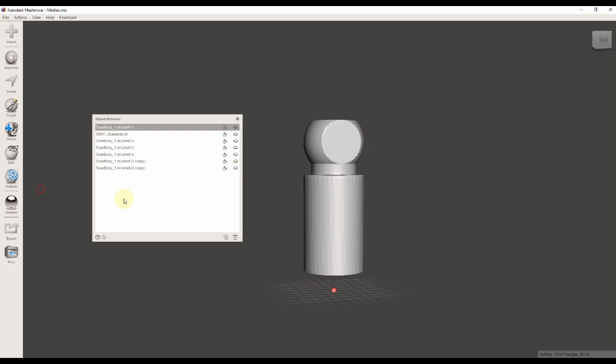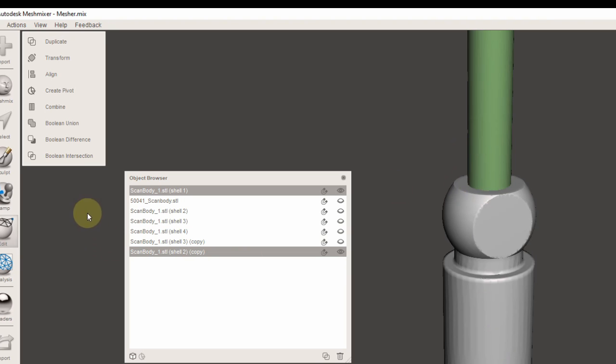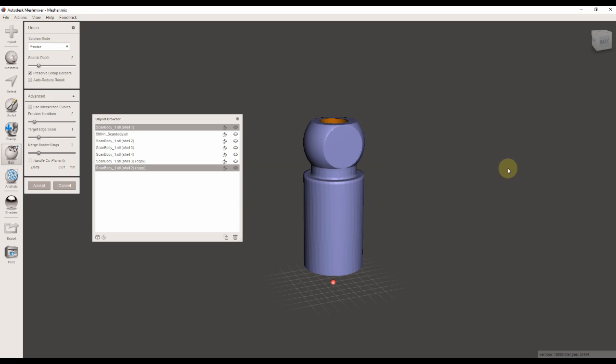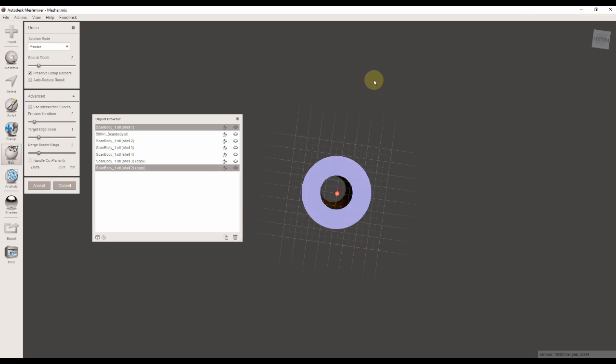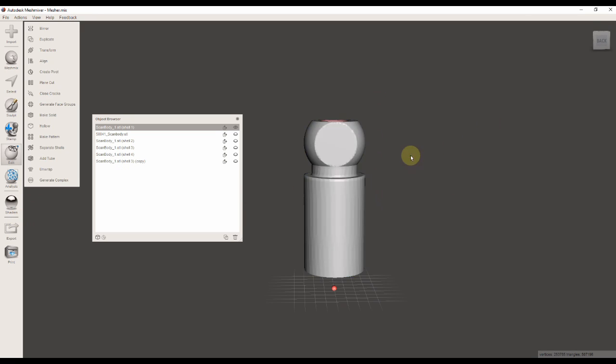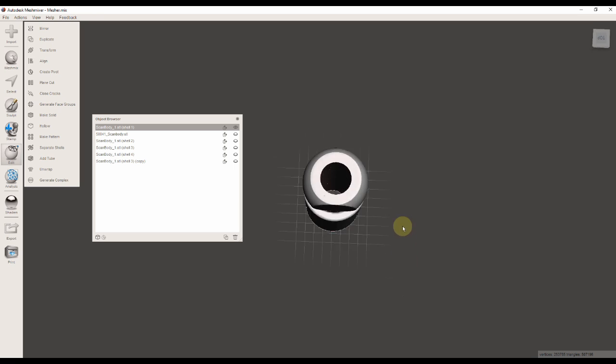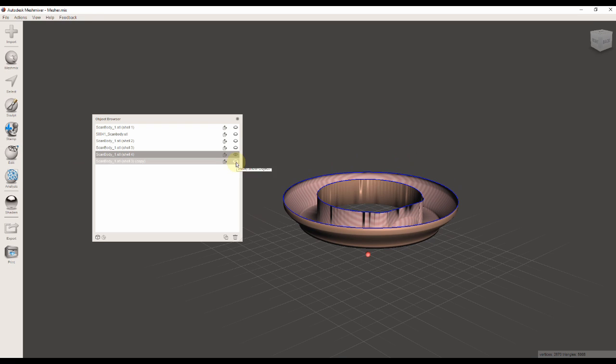Now we're going to select the STL and the screw channel and select Boolean Difference from the menu. We're going to cut a perfectly straight hole and accept the modification.